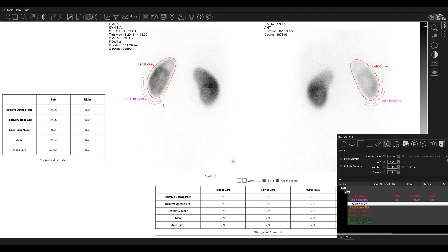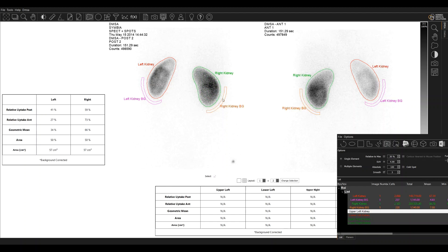The left background ROI is automatically placed. That can be redrawn if for some reason that's not in the correct place. I will do the same for the right kidney like that.